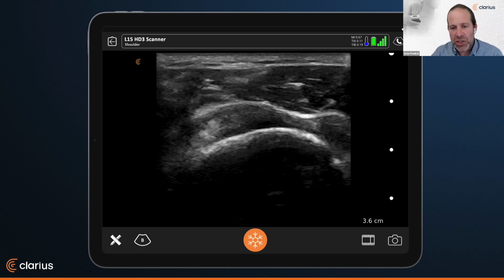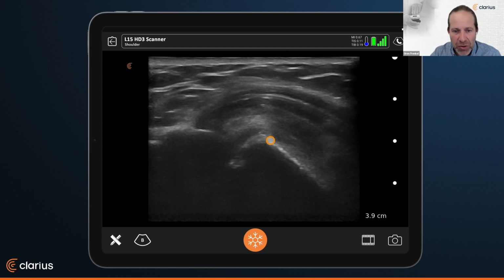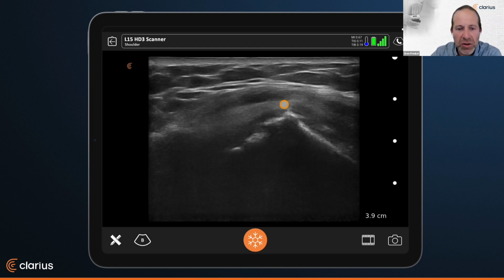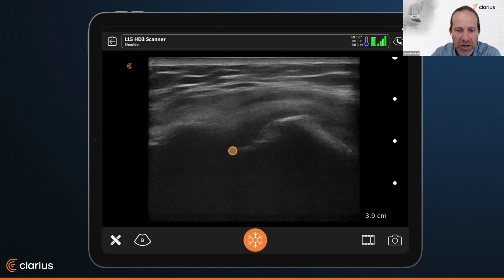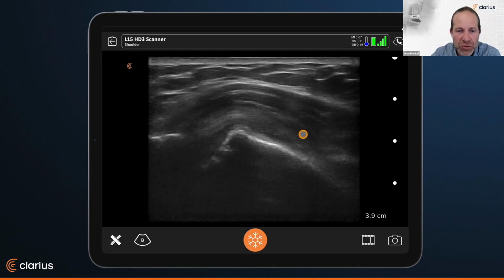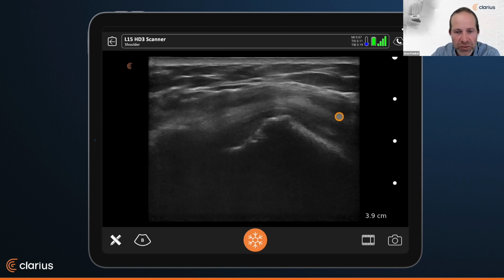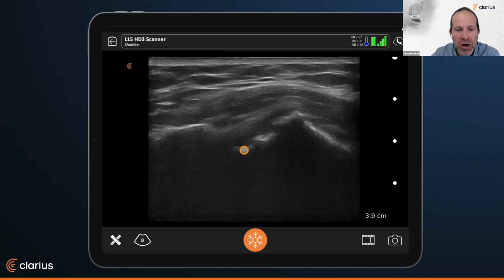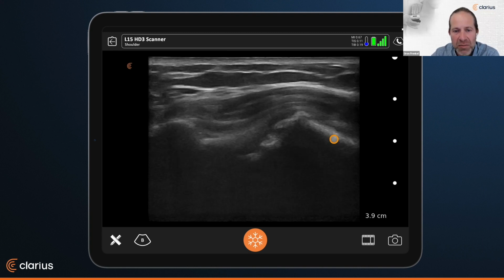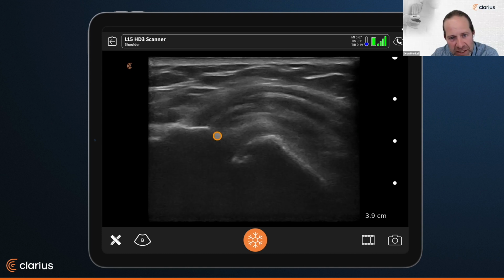And then lastly, we wanted to show this quick example of an impingement. It's a short clip, but here we have the acromion on the side, and you can see what you had referred to as the cortical irregularity of the humeral head, highlighted in the scan. And this is a patient who's trying to abduct their shoulder, and you can watch in real time, essentially bonking against the acromion, probably in the setting of a tear that is causing instability there.